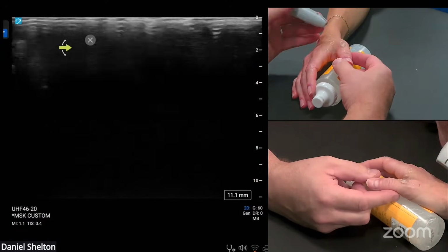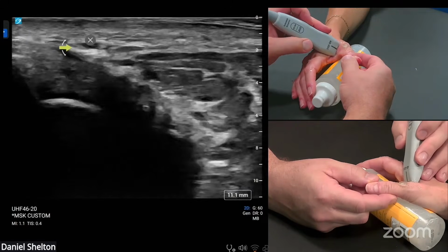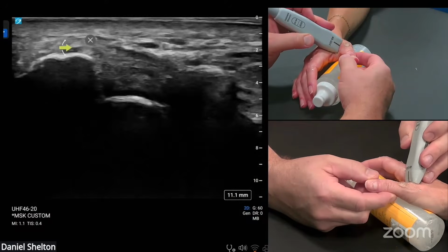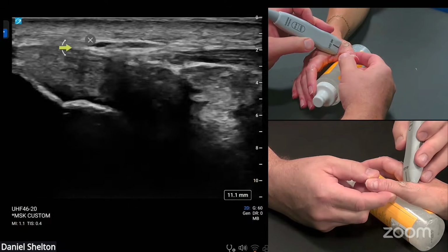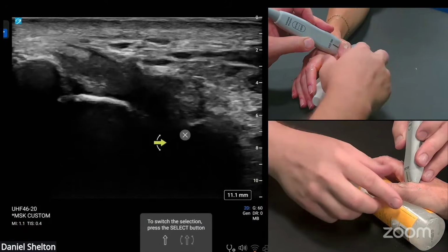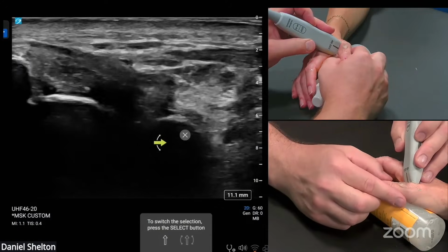To see the accessory in this case is very difficult. It's not impossible. So there it is. The accessory is here, and it's going to look like a supraspinatus in the shoulder. And it's taking that extreme dive towards the, I would say, normal volar plate of the first digit, but it's going to go up to the sesamoid. So we should see the ulnar side sesamoid right there.